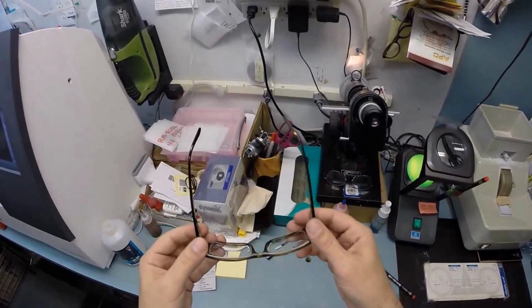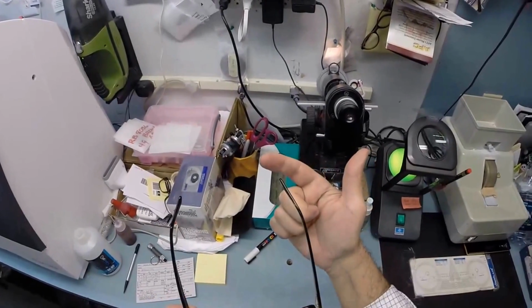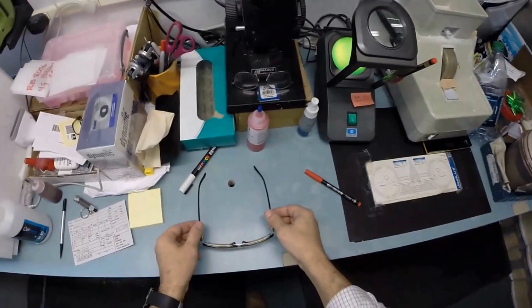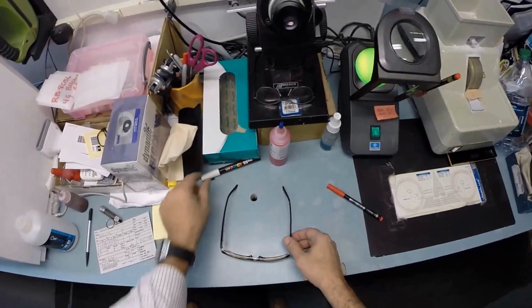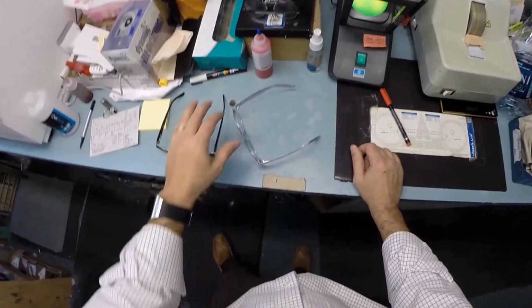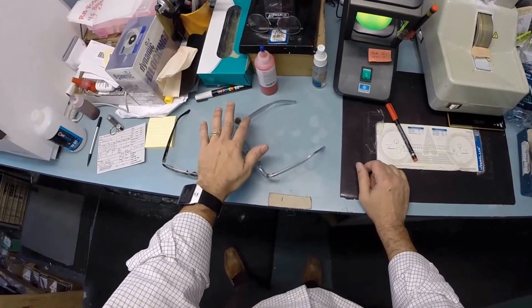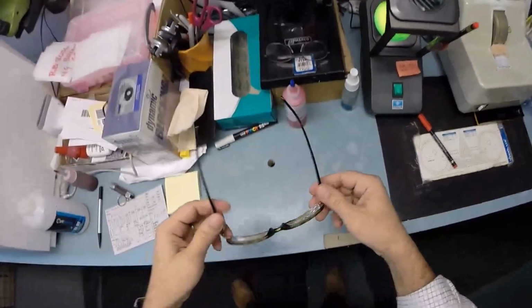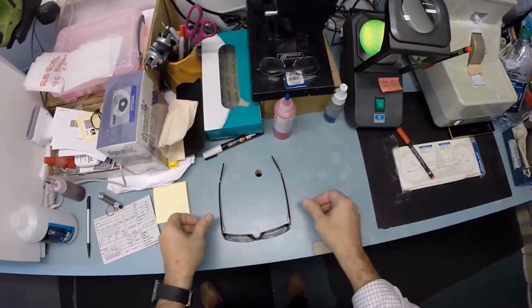But I'm going to get them in standard alignment, also known as a 3-point stance. Those 3 points are 1, 2, and the bottom of the frame being 3. I set it on the counter and press down. There is no wobble. When I say wobble, I am part of that 80%. When I take mine off and I press down, they wobble on the counter, but they sit level on me. Let me put mine back on so I can see what I'm doing. Alright, now I flip it over, press down, there is no wobble.